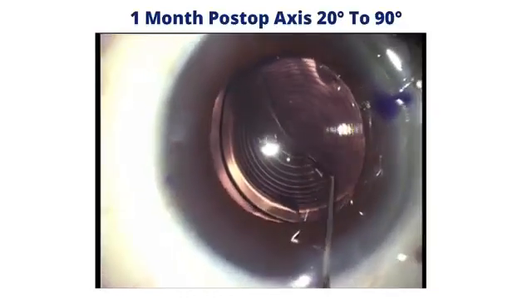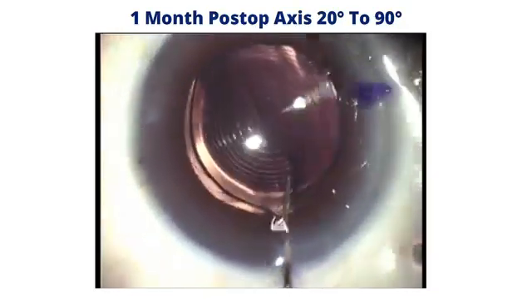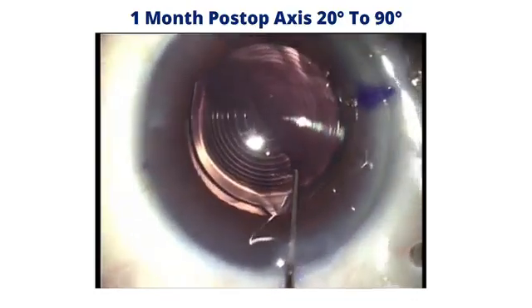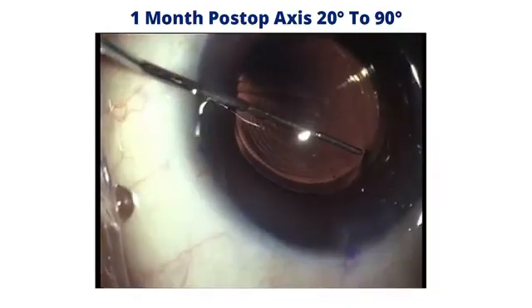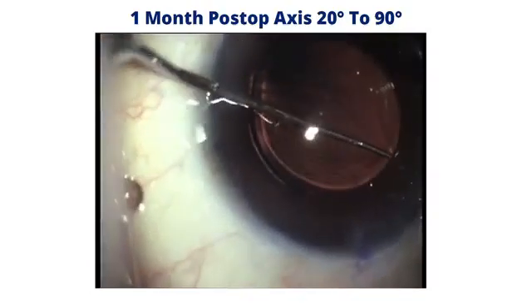So you can see that in this particular video, there is hardly any capsular fibrosis in this multifocal lens with the toric axis, and you can see the markings of the toric lens. So first thing to do is inject viscoelastic. Resist injecting too much, because remember, you're going to inject some behind the lens.